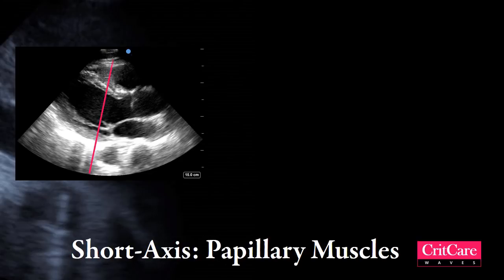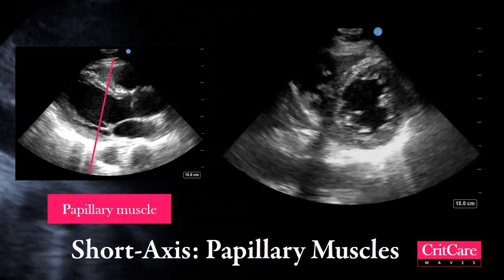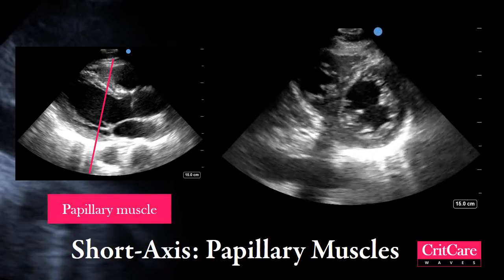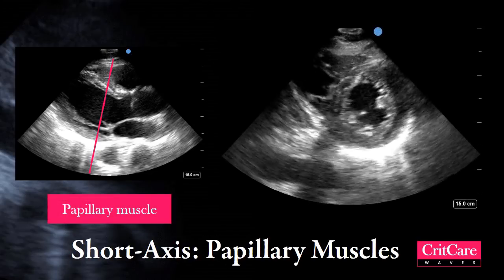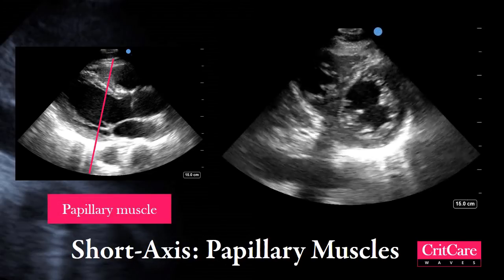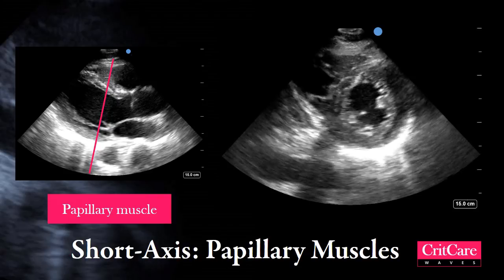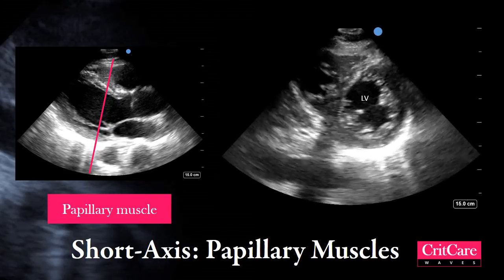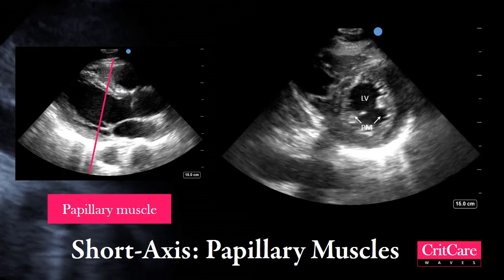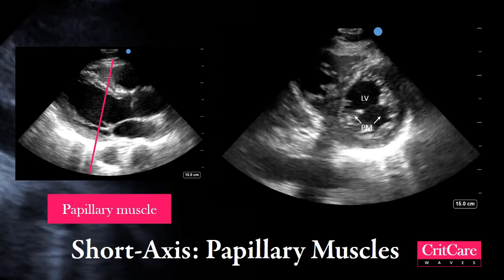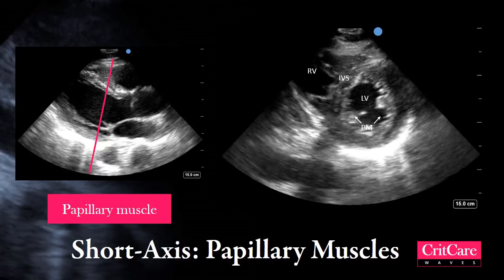The first view is the parasternal short axis at the level of the papillary muscles. The thick-walled left ventricle is apparent, as well as the papillary muscles. The right ventricle is by its side with the interventricular septum in between.